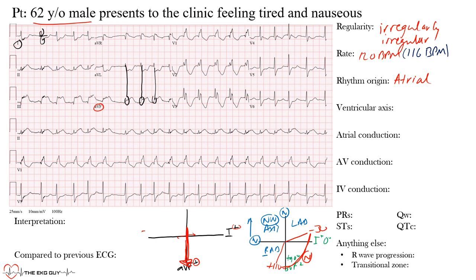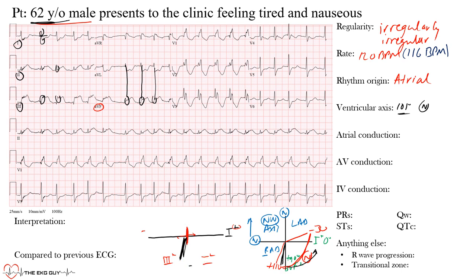Another way to look at this: lead II sits at positive 60 degrees and lead III at positive 120 degrees. Comparing them, lead III appears more positive than lead II, so the axis lies further in that direction. The machine gave us 101 degrees — a normal axis, but on the rightward side. As we age, the axis tends to shift more leftward as the left ventricle becomes dominant, so this rightward shift at 101 degrees is something to keep on the radar.